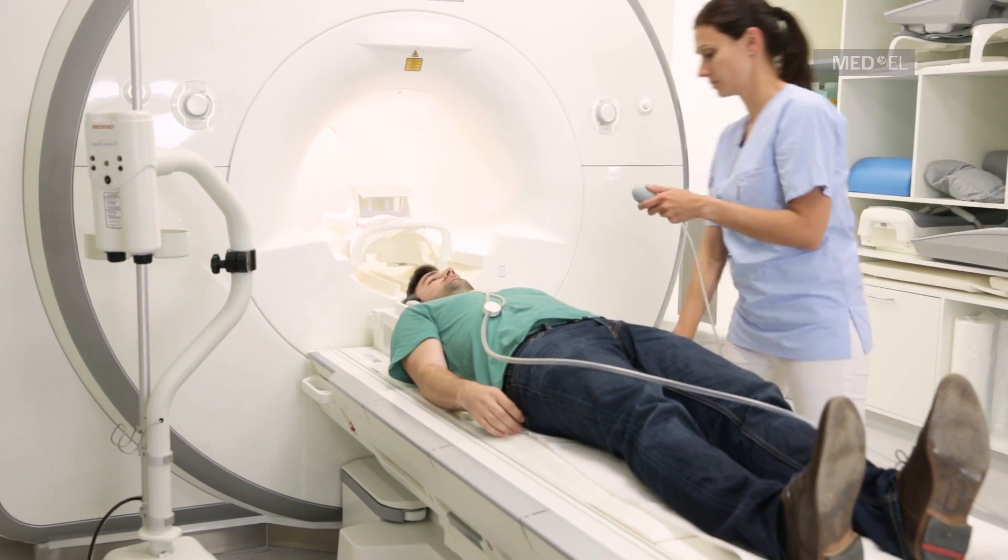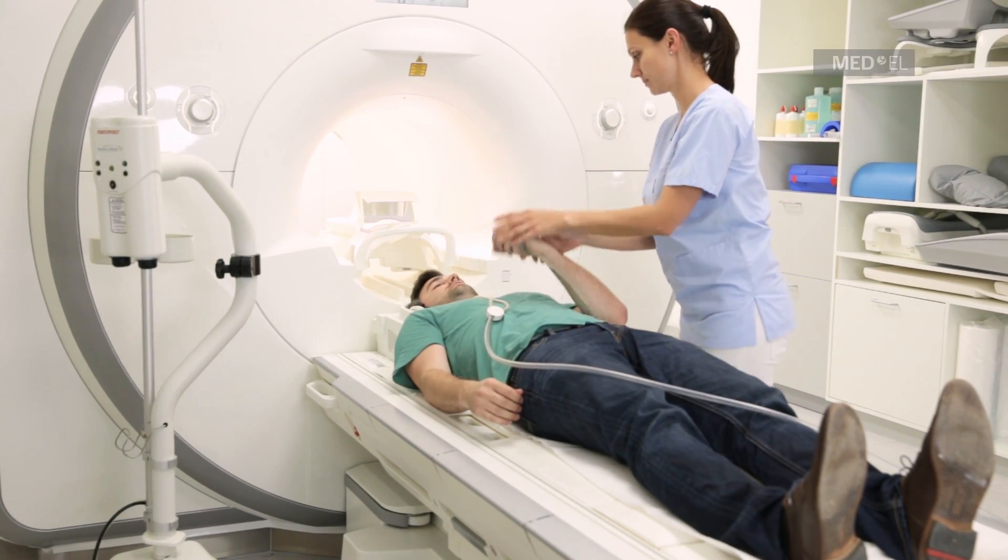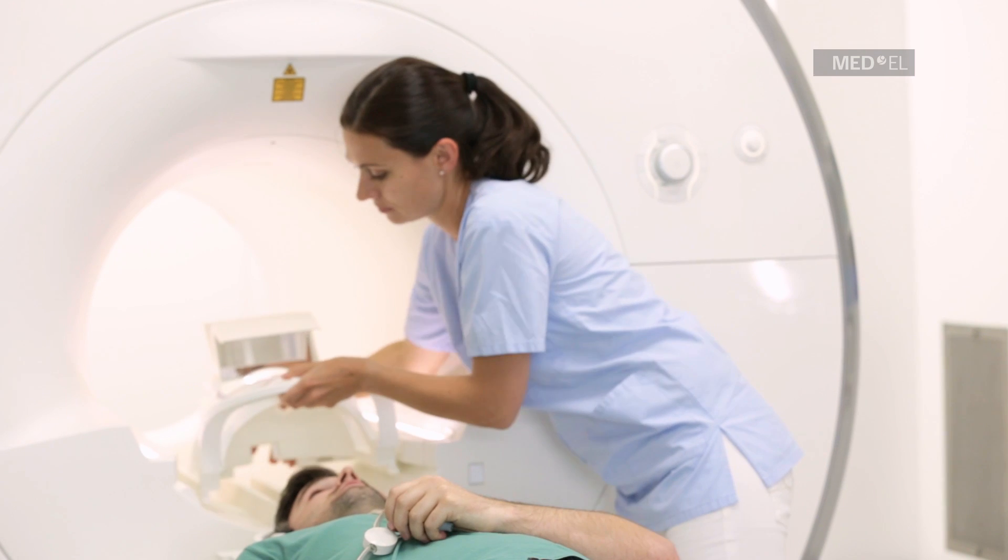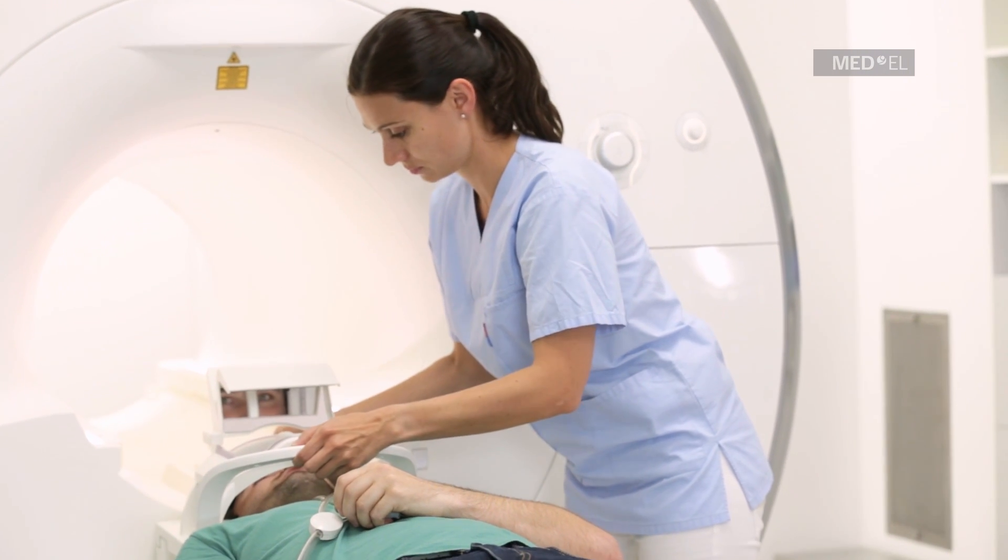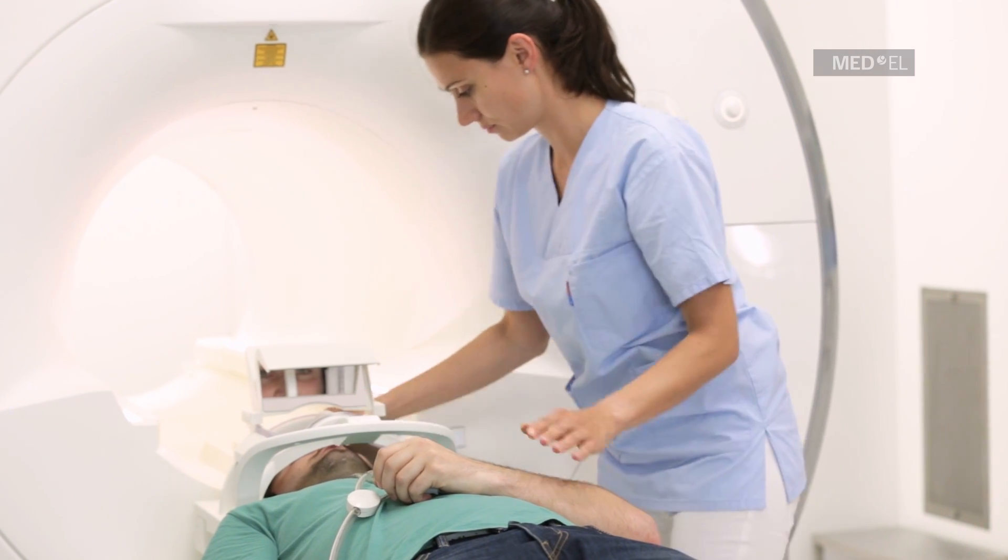For three Tesla scans with a synchrony cochlear implant, head transmit coils or multi-channel transmit coils cannot be used. Local receiver-only coils can be used.